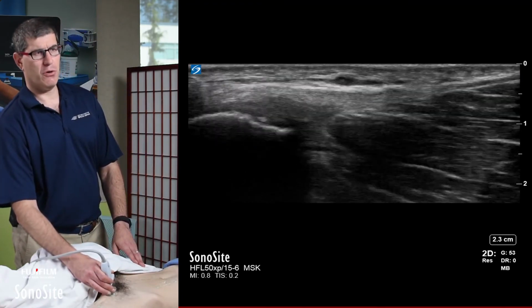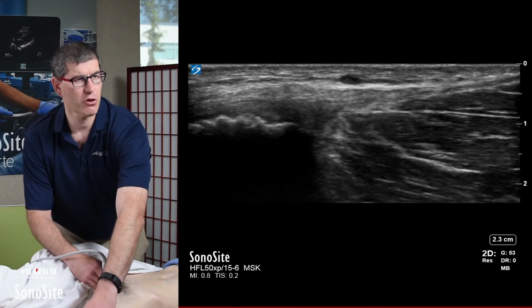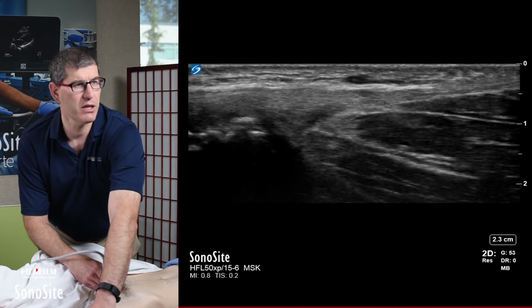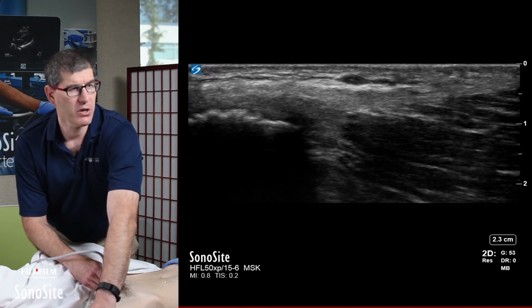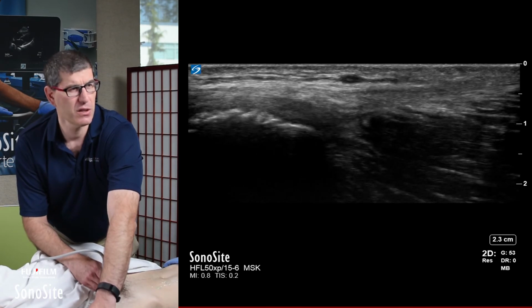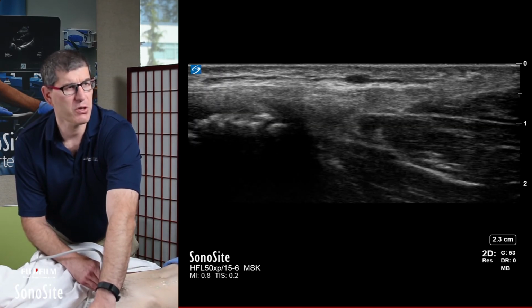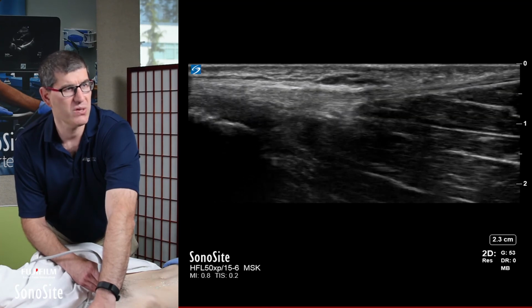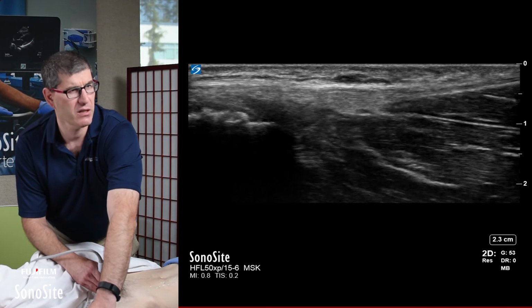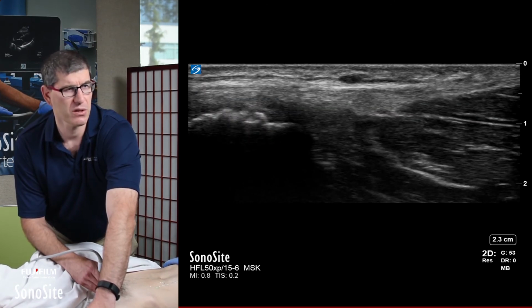And what I'm going to do is I'm actually going to reach across, and then first I'm just going to passively try to push his tendon into adduction. I can also instruct the patient, can you push upward on my hand? And that's going to be really valuable, especially for a myotendinous injury where you may see some gapping form between the muscle and the tendon. So go ahead and give that exertion again. Fantastic. So that's going to be the assessment for sports hernia complex injury using musculoskeletal ultrasound.